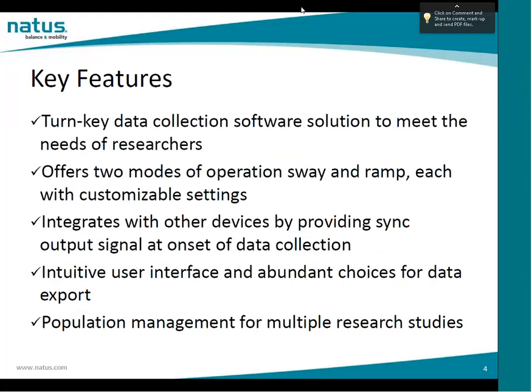The key features: it offers a turnkey data collection software solution to meet the needs of researchers. It offers 2 modes of operation, sway and ramp, each with customizable settings. It integrates with other devices by providing a sync output signal at onset of data collection, an intuitive user interface, and abundant choices for data export. It offers population management for multiple research studies.